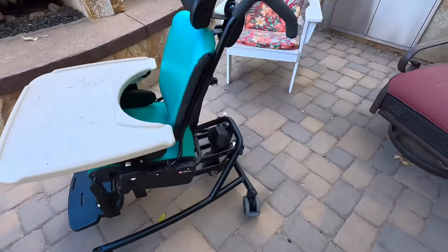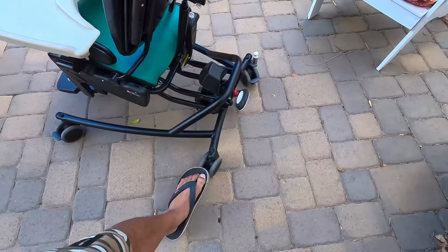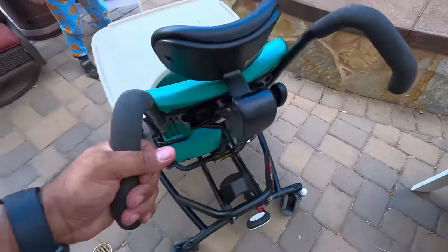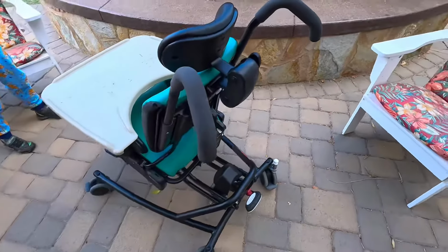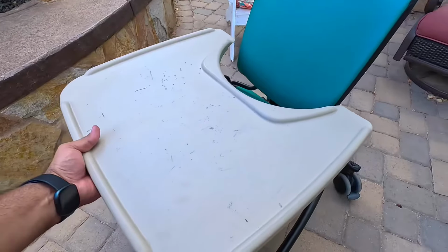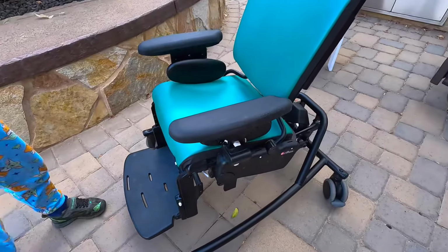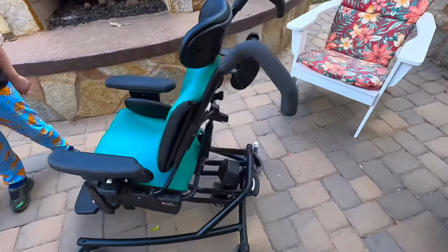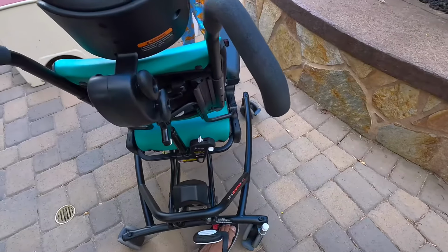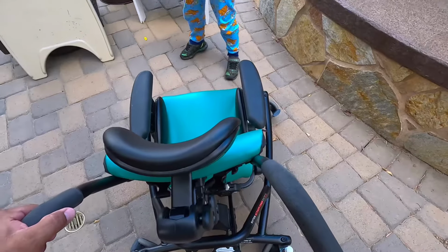So all you have to do is, I would at the very minimum lock two casters. You just simply push down on the caster lock, and then you can check and make sure that the chair is stabilized. Of course, if the tray is in, then you'll need to take it out. And then, unless the chair is on the ground, which it likely isn't, you would lift the foot pump along with the red trigger to lower it all the way.